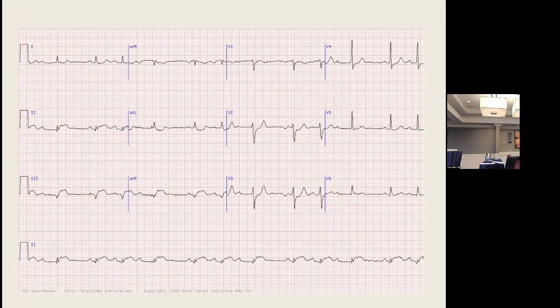So if we got to the third eye, so we went intervals and enlargements, which we haven't really talked about yet, 4 chambers. The third eye, the triad, ischemia, injury, infarction. If we got to the third eye, you recognize that in leads 2, 3, and AVF, Q waves are starting to form. And there's ST elevation that blends right into the T wave.